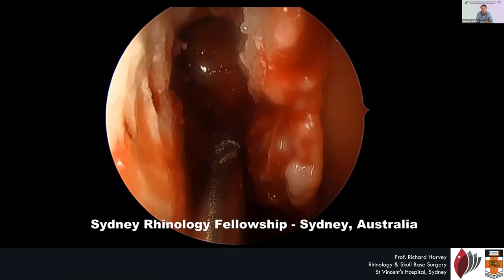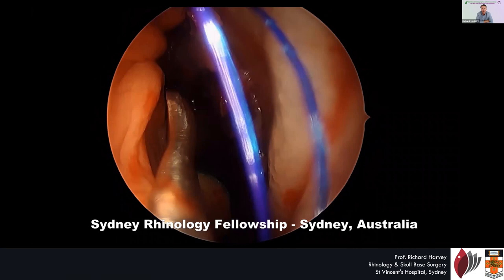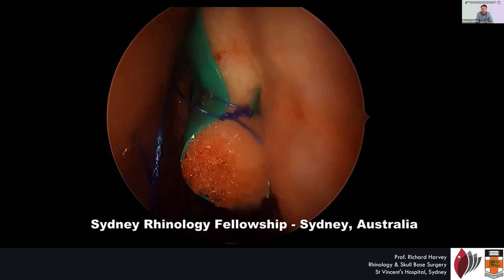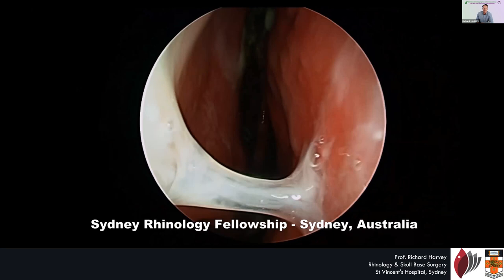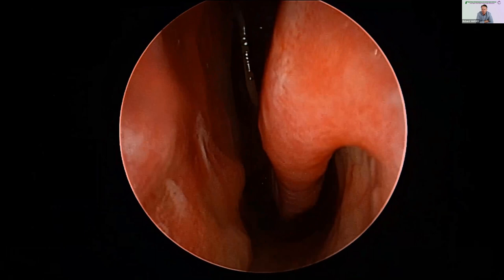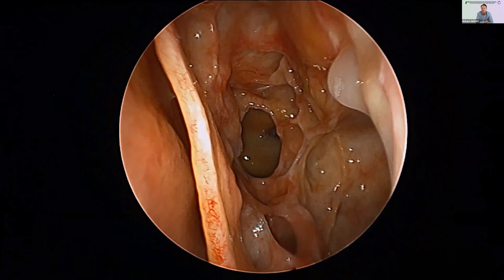We used to just put a little free graft of mucosa over that bit of bone and then pack it. That healed okay — it wasn't perfect, but it healed okay. You can see at three weeks there's a bit of crusting, and then when he reaches three months he's got a good result. But there was a bit of crusting around the raw bone, and the free graft doesn't always take.